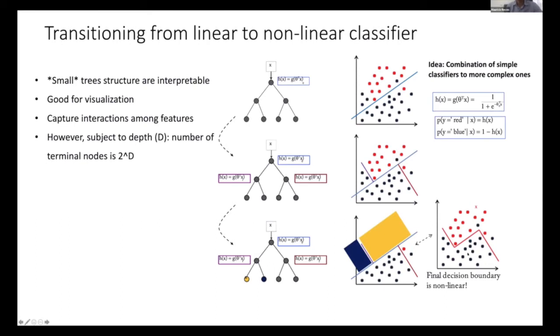This could be, for example, a cancer versus non-cancer model. And explaining this whole rule set might be more complex, but explaining the individual rules is simpler. Okay, so in essence, a decision tree is rather interpretable, but it depends on the depth of the model and also the complexity of the individual features. Typically in the past, before deep learning, we used to hand-engineer or handcraft our features. We would design them based on a priori information, based on clinical facts, based on studies. We would actually engineer that information into a decision tree.